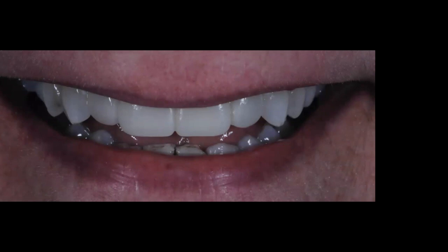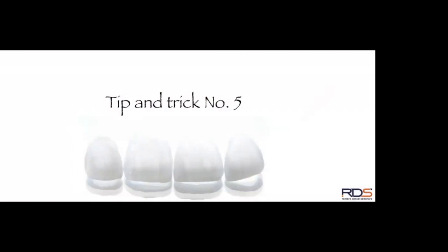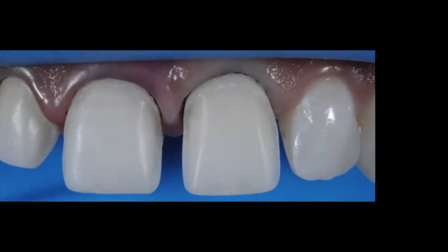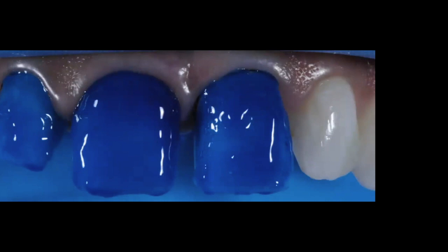Now tip and trick number five — bonding the veneers. You have your veneers back from the lab and you're ready to bond. Look at this case: following these techniques I'm delivering three porcelain veneers with 100 percent full enamel on teeth 7, 8, and 9. Because you have full enamel, you can use a total-etch technique, which we all know is very predictable.